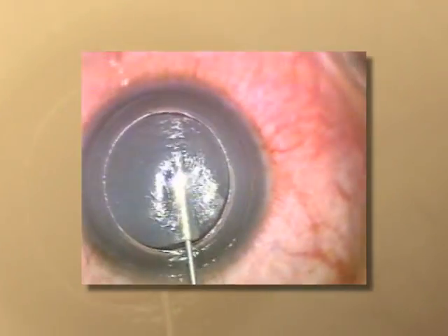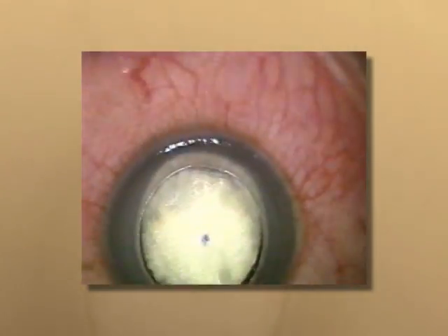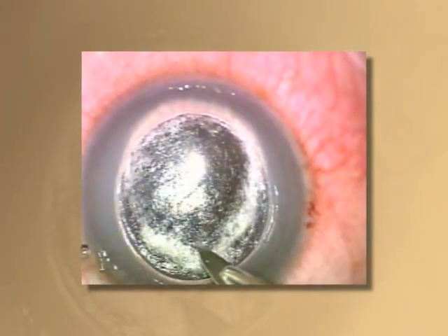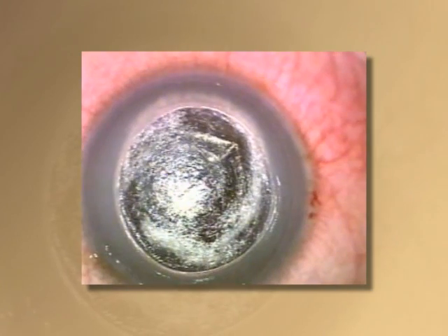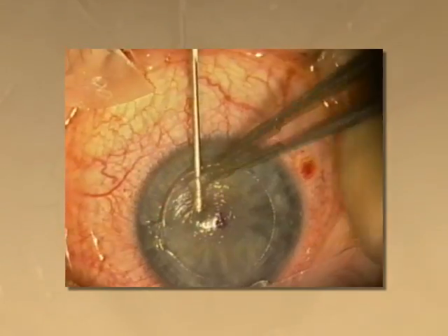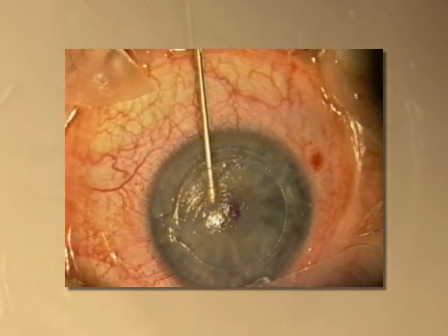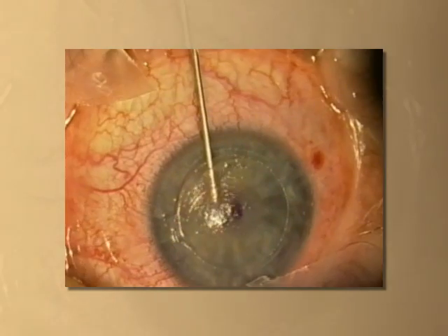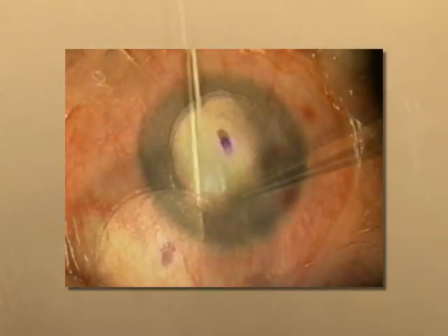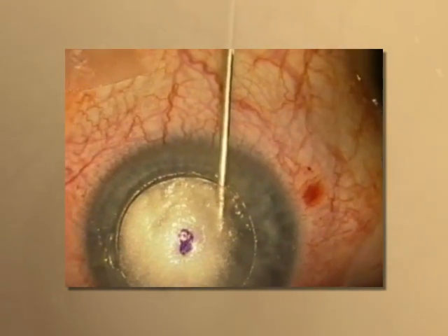The Anwar technique of air injection to bare the Descemet's membrane is a popular technique due to the advantage of reduced surgical duration and complete baring of the Descemet's. In our experience, the two major problems with big bubble deep anterior lamellar keratoplasty have been the identification of formation and the recognition of an adequate big bubble.